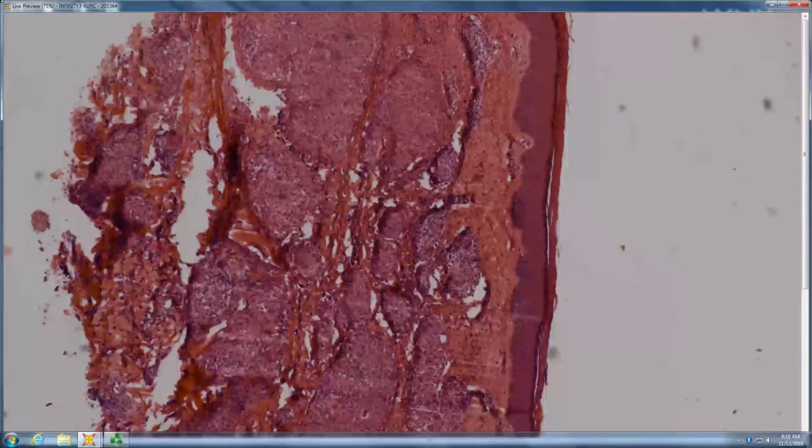Yeah. So tell me about silica. So say we polarize this and it's full of silica. What's that? That's still sarcoidosis, right? So silica granuloma, the silica is just a nidus. Who, show of hands, who here has not skinned their knee when they were little? You all have silica in your skin. Who gets the granulomas? People with a tendency for sarcoid. So silica granuloma, they all get followed for sarcoidosis.